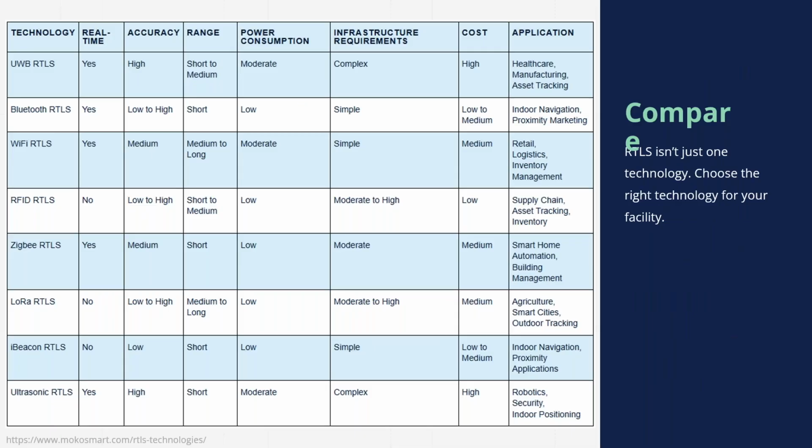Say that again. Yeah, the tag size. They're too big. So the tags are too big. That's another item, like I said, that hinders an RTLS system. So there's some work that needs to be done. They are useful. I've seen that they're useful. But just know some of those potential hiccups. If you're getting one, I've had one person say it's the greatest thing in the world. What makes it work for that person? And then think about this slide: do I have the wrong type of technology with my RTLS?